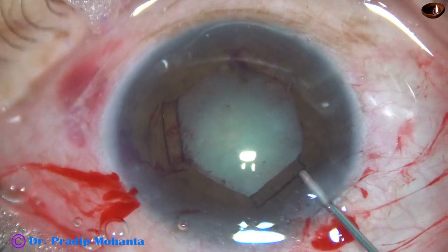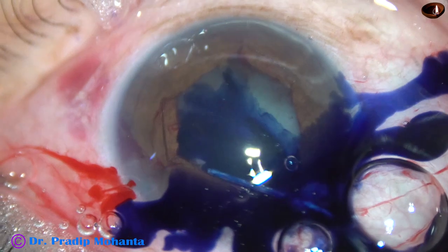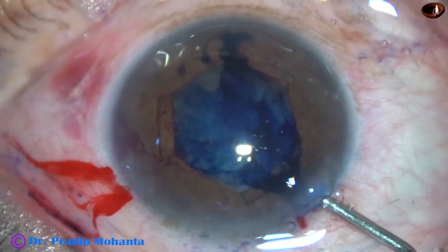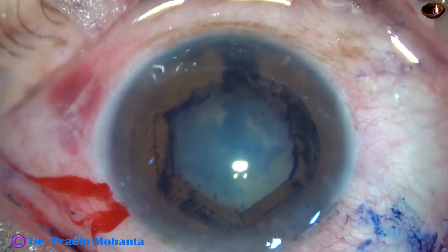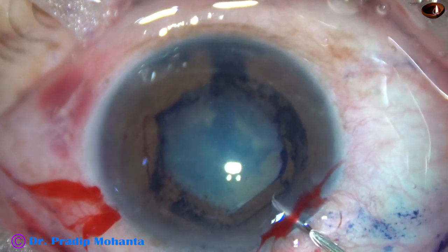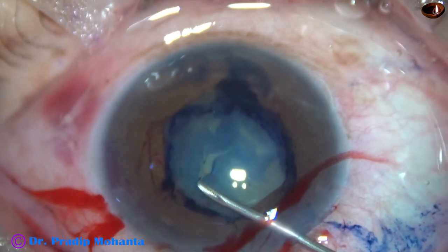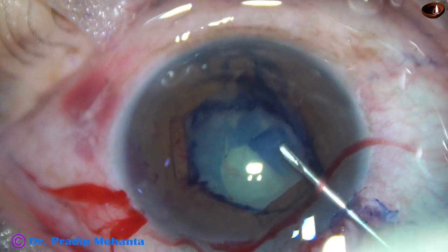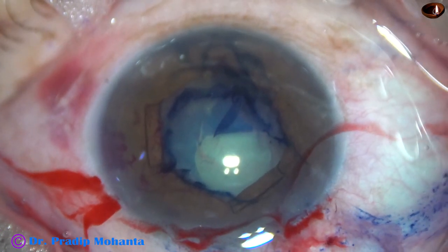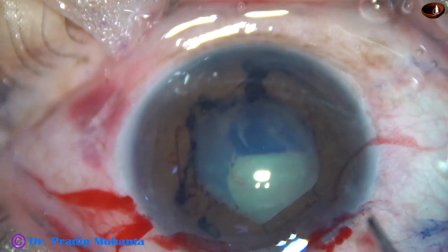And now I am going to stain the anterior capsule. I am just placing the trypan blue dye over the anterior capsule — touching the anterior capsule as if I am painting onto it. Now I inject visco. I took a 26-gauge bent needle and I am trying to do a portion of the rhexis with this needle itself — from 1 o'clock to about 9 o'clock, about 4 clock hours have been done by this needle. And now again I inject visco.